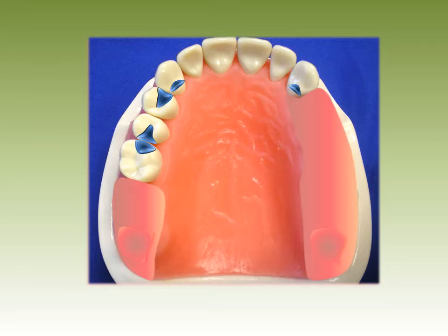A cingulum rest is placed on the lingual of numbers 6 and 11. That puts our fulcrum line as shown in the illustration.